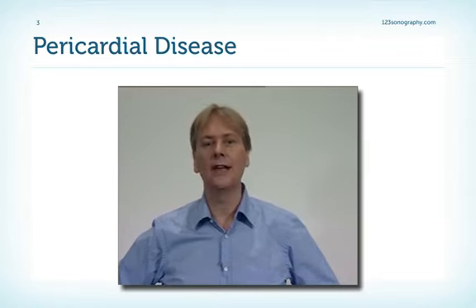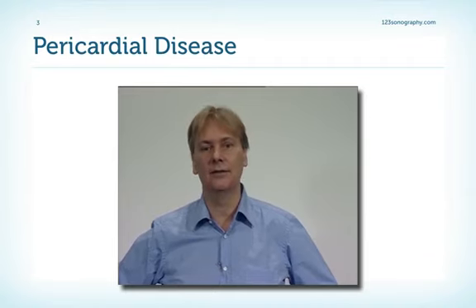In this chapter, we'll find out more about pericardial disease. We'll talk about pericardial effusion, tamponade, constriction, and other forms of diseases that can affect the pericardium.